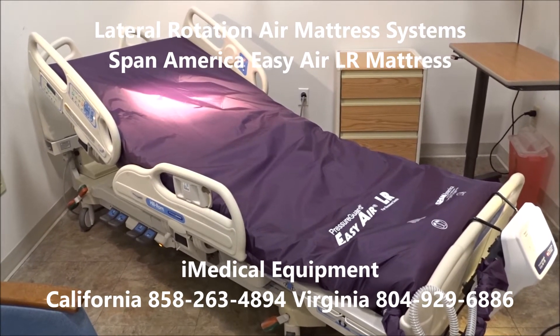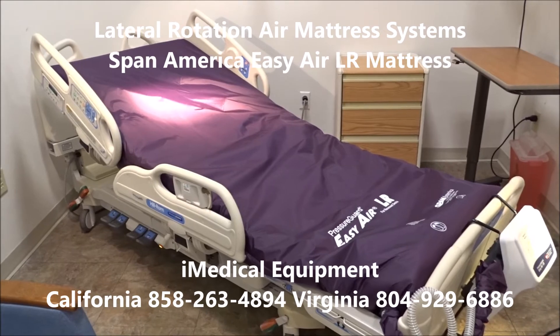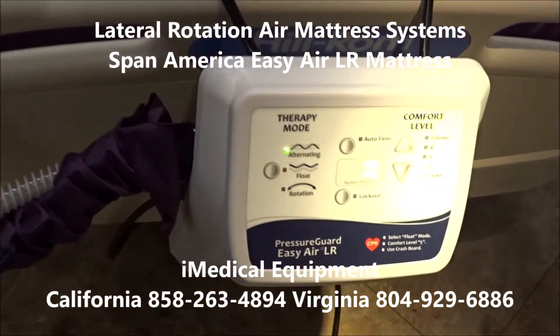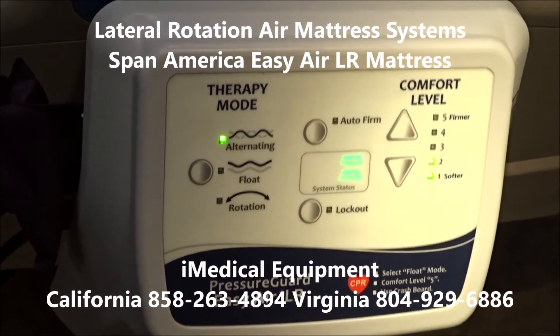If that's the case, this is going to be a bulletproof system. The SpanAmerica mattress system comes with a two-year warranty, so it's very reliable and super high quality.